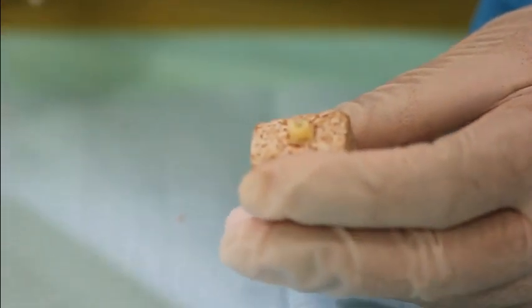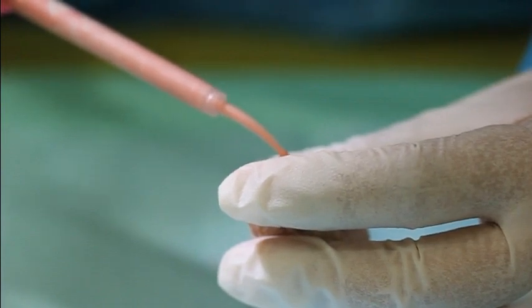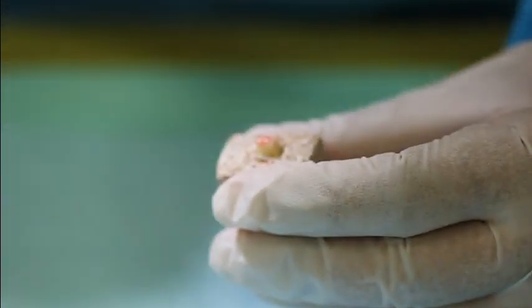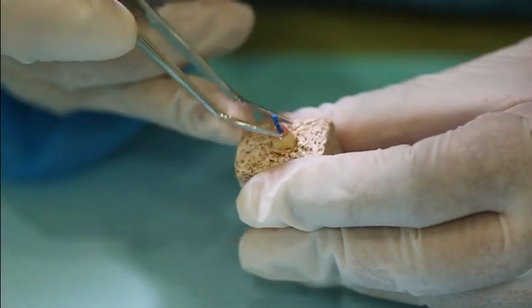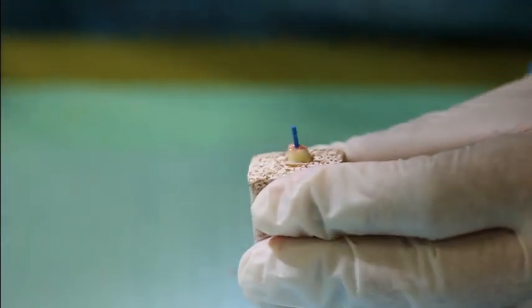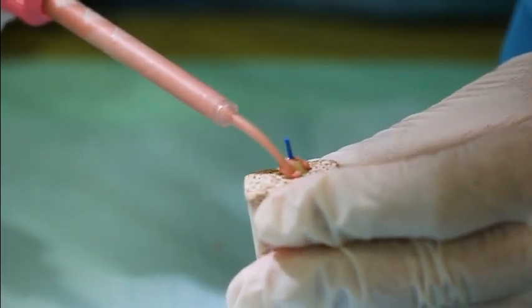Load your light body inside the canal. Place the impression post immediately. Make sure it sits correctly. And don't forget to put light body around the margins of your preparation as well.